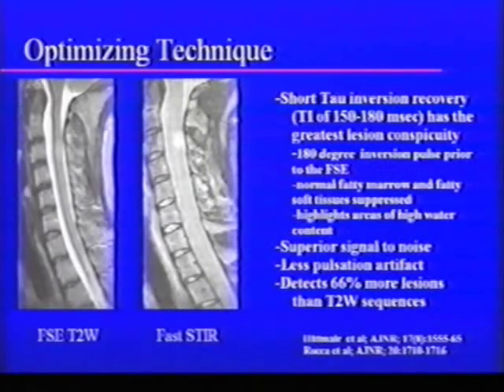There's now a technique called a fast STIR sequence. This is available on most scanners that are in the community. A lot of folks aren't doing it, but they should. STIR refers to short tau inversion recovery. STIR. We're simple people in radiology. We want to be able to remember it. STIR. Okay? Short tau. When you do a FLAIR, you suppress the fluid. Okay? But when you do this shorter tau, which refers to something called an inversion time, you suppress fat.